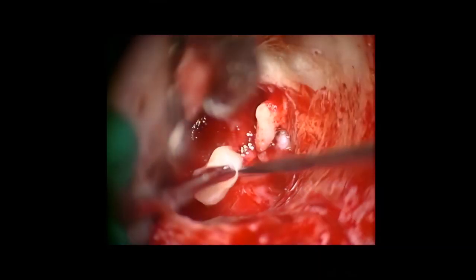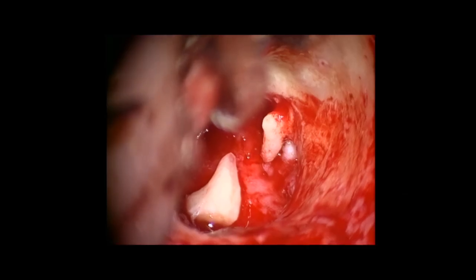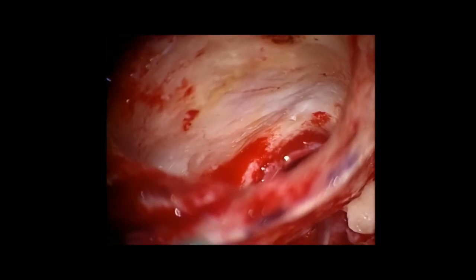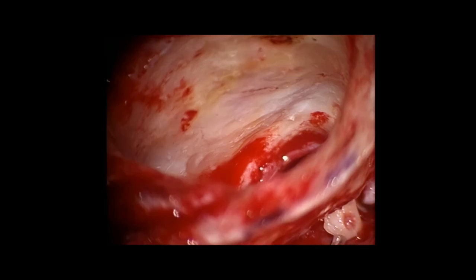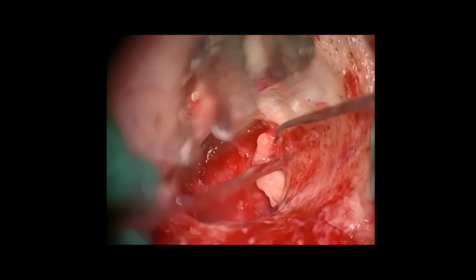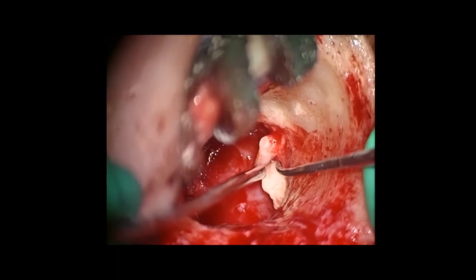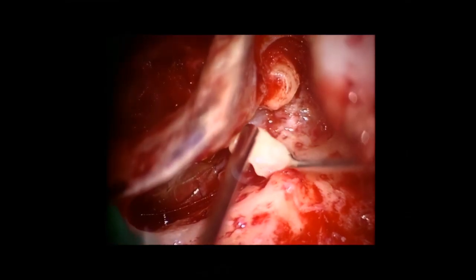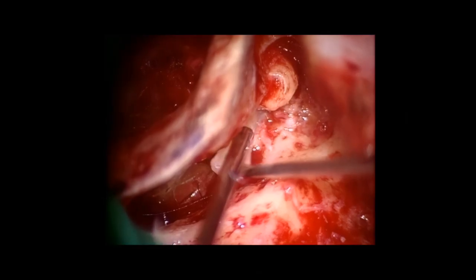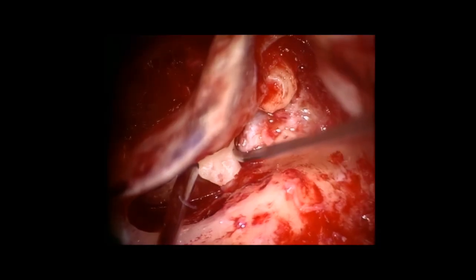An incus interposition is a very stable reconstruction because it is less subject to erosion due to its natural formation and shape as a natural ossicular bone. I am placing it in position first before any tympanic membrane reconstruction, just to be sure that the size and the contacts are correct. Here you can see how it sits nicely with good mobility between the stapes and the malleus left in position. I am using both a posterior tympanotomy view as well as a transcanal view.